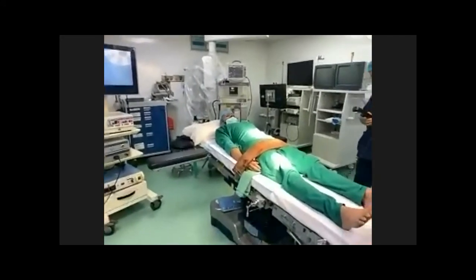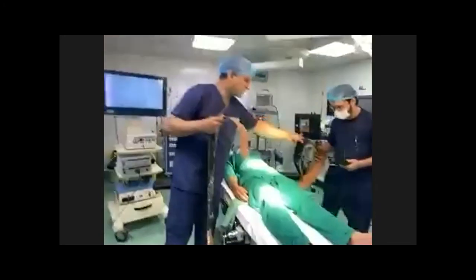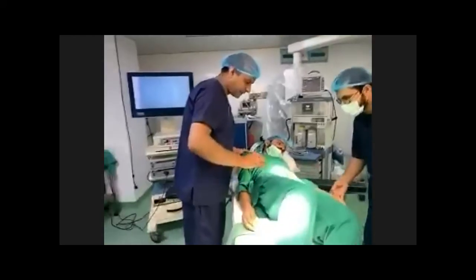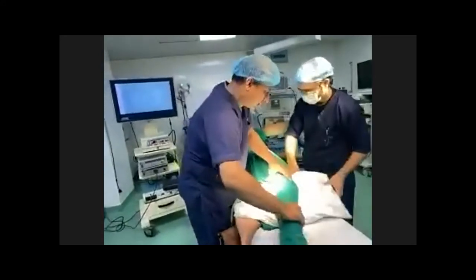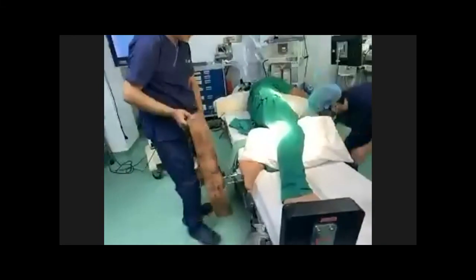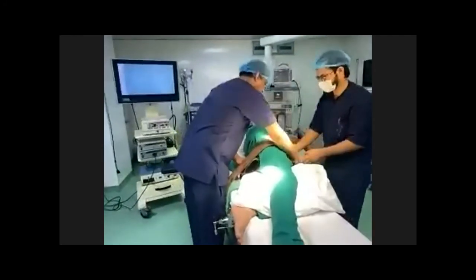Another position which we usually use is called the lateral position, which we use in nephrectomies and colorectal procedures. In this position, we put the patient on his side and make him comfortable by putting support like this, and we apply the belt again for safety.